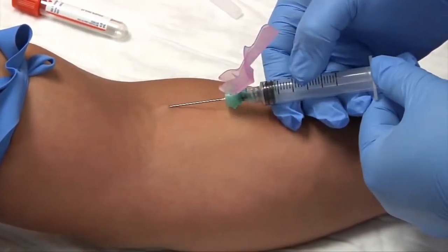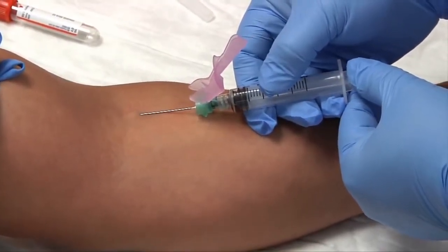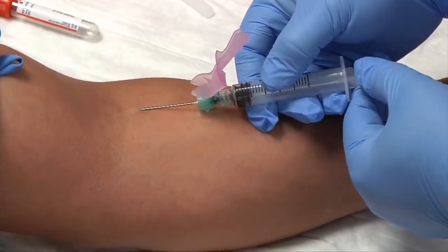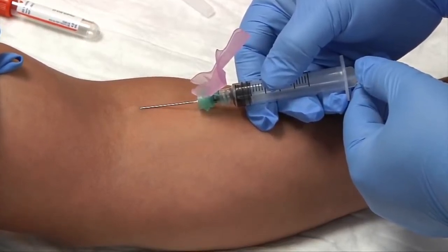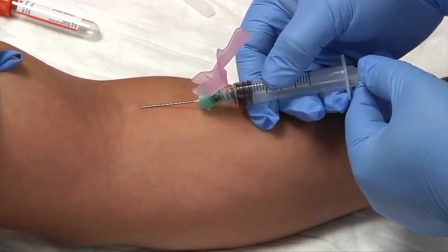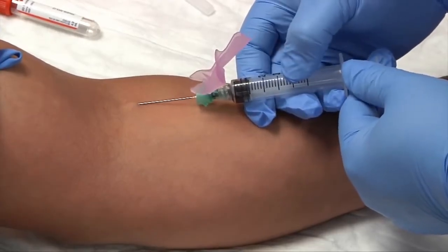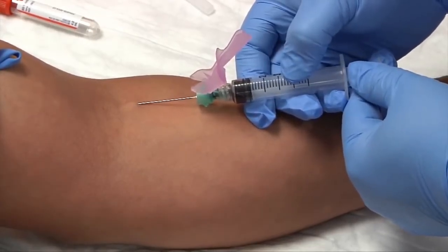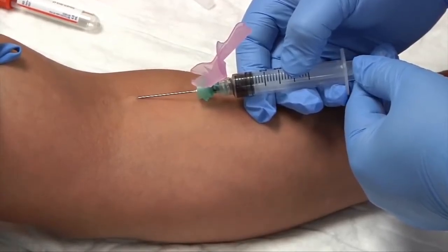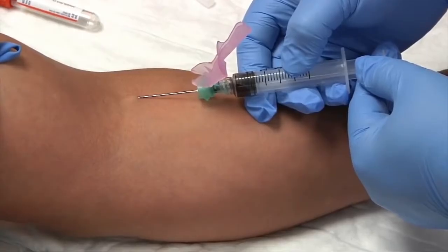You want to slowly pull back. With this test that I'll be performing, it's a serum test, I'll need 3 milliliters of blood. So very slowly I'll pull back the plunger until I have 3 milliliters of blood. I can tell when I have 3 milliliters of blood because my syringe is a graduated cylinder, which means it's been marked on the side. You'll see the blood slowly move in, gradually pull back your plunger.